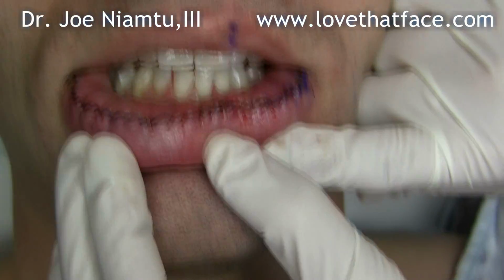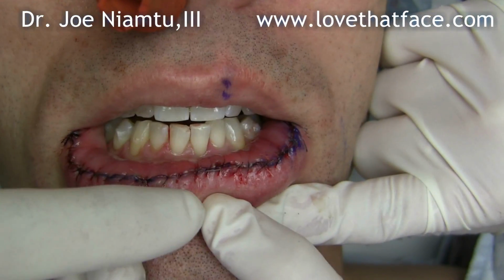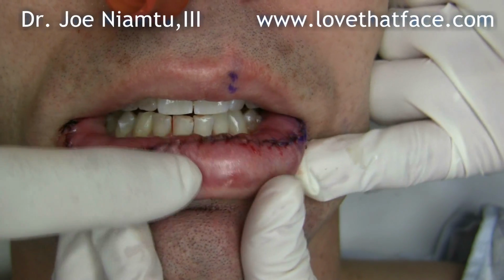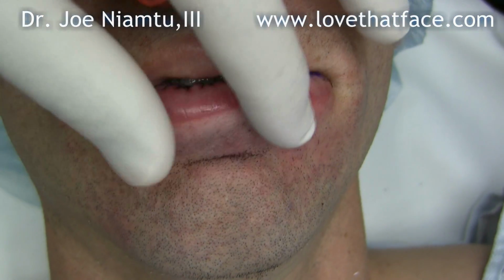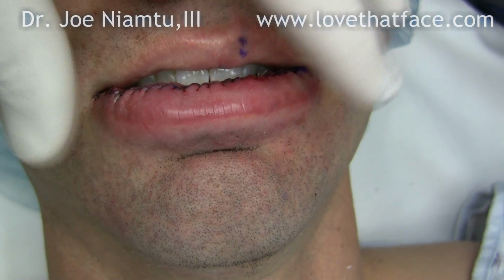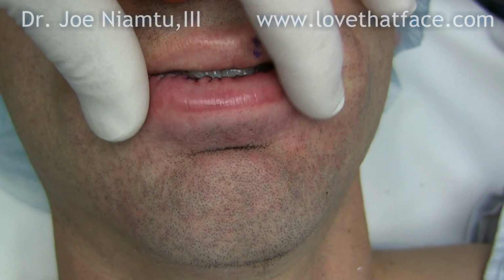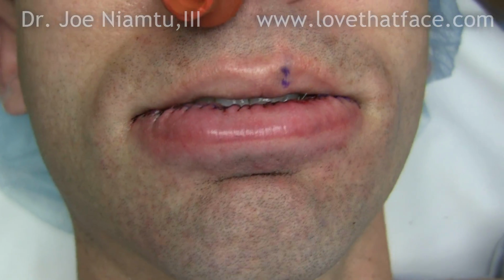Okay, so we're finished here. I guess this took about 25 minutes to do, and here is our final closure. With the 6/0 silk, we'll probably leave that in for a week or a little bit longer. And right now you'll see that suture line, but when the edema goes down, it'll be hidden. So that's our lip reduction on a Caucasian patient.